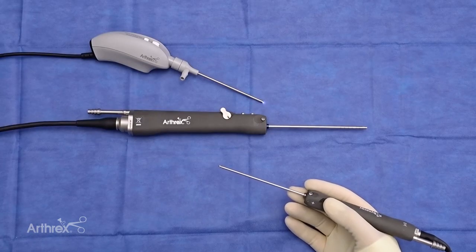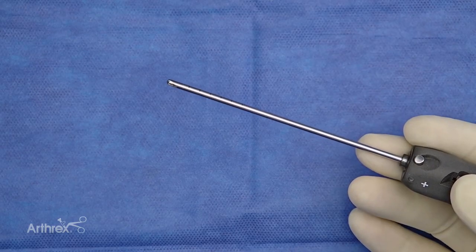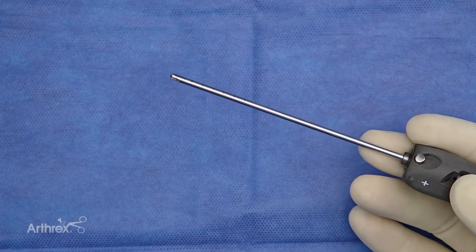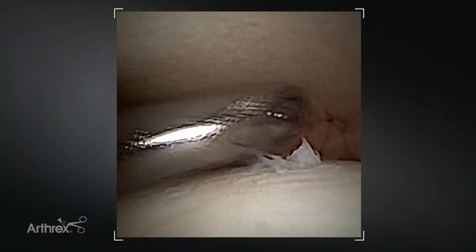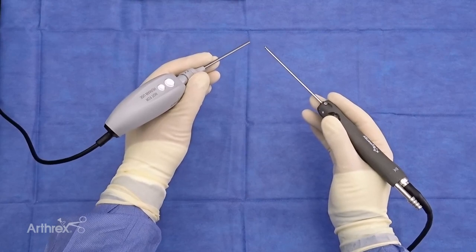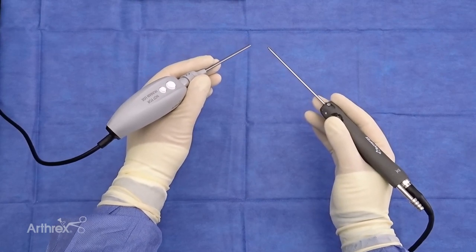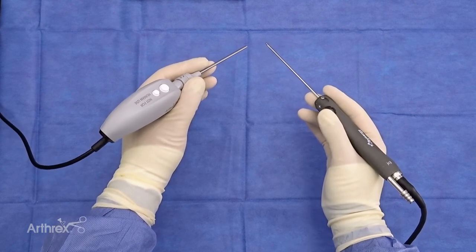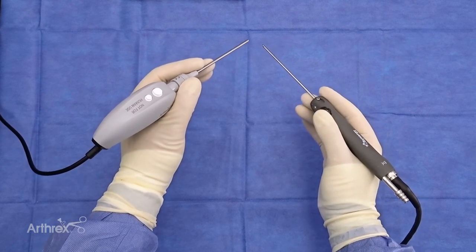As surgeons evolve to using more nano arthroscopy, whether it's in the office or in the operating room, the ability to use a longer working length shaver with a lighter handpiece will allow the surgeon to utilize the finer resection instrumentation, whether it's in the knee, the shoulder, or the ankle. The combination of the Nano Sabre Shaver allows you to ergonomically balance the handpieces when you're holding the lighter weight Nano scope.